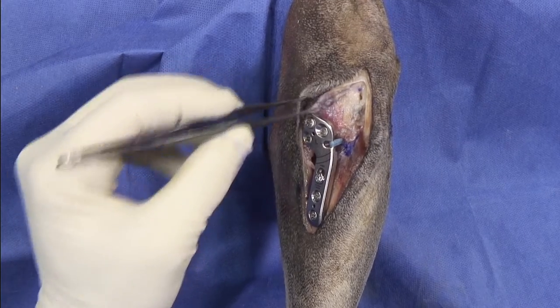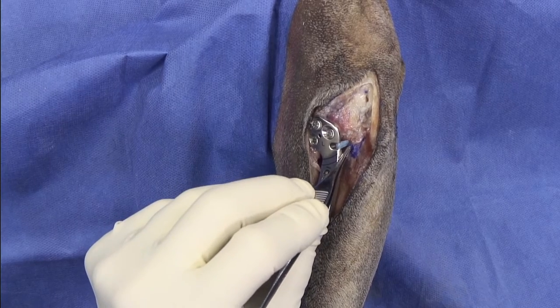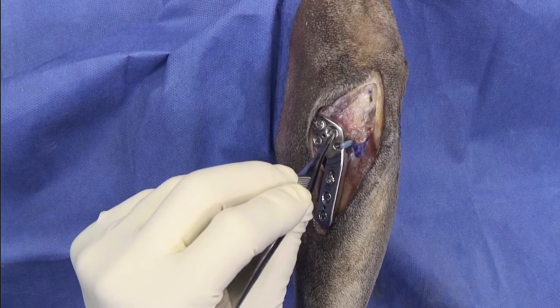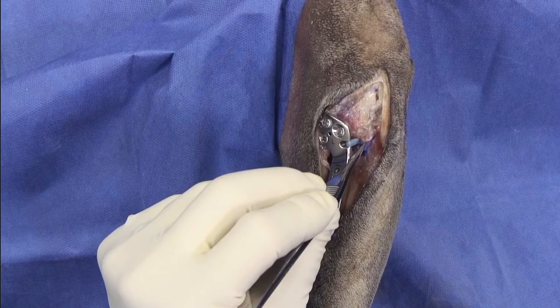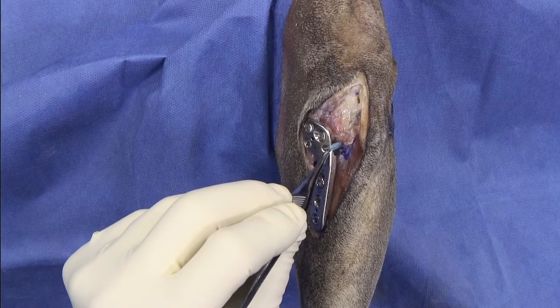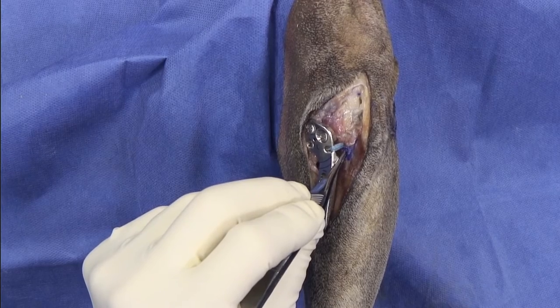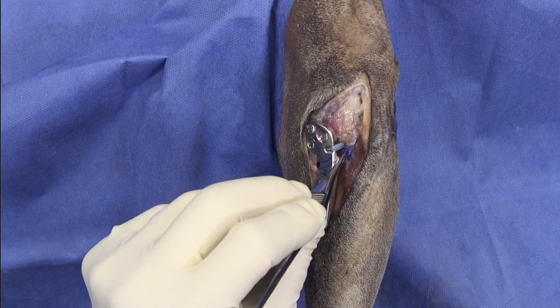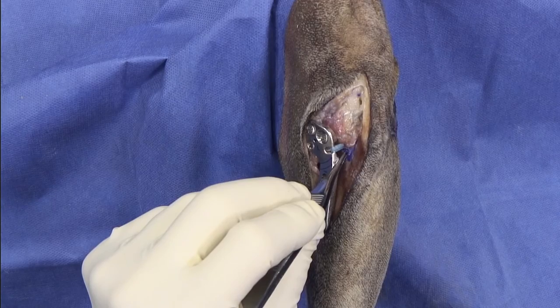I want you to notice that the bone tunnel is in a good position — it's immediately cranial to the most cranial screw, about two millimeters from the osteotomy. Also note that because the tunnel is immediately below the suture hole, it's important when drilling to not advance the drill against the plate, because you can partially damage the edges of the suture hole, which may predispose to fiber tape failure.